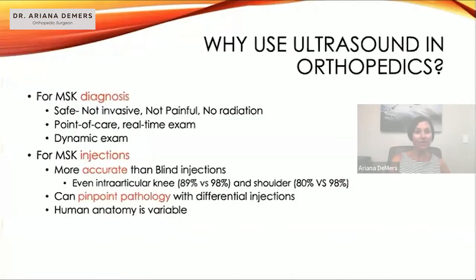So let's delve in. Why use ultrasound in orthopedics? Two reasons. One is for diagnosis. It's safe, it's non-invasive, there's no radiation, and you can use it at point of care in real time with a dynamic exam. So you can watch things moving in real time.